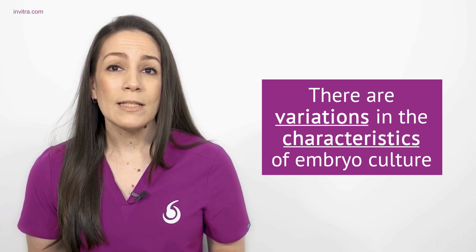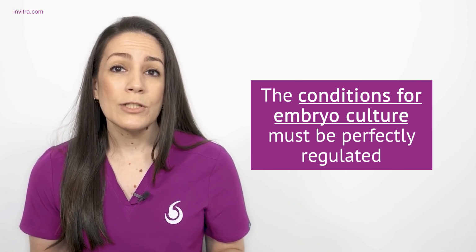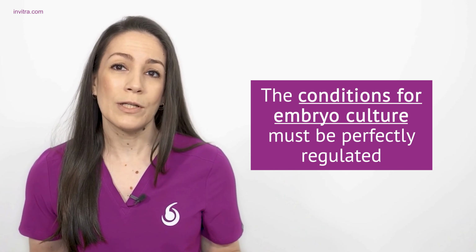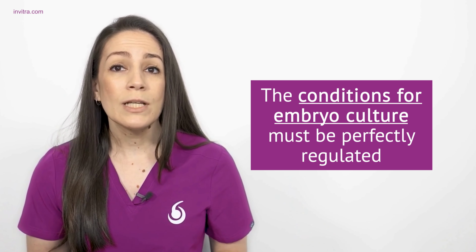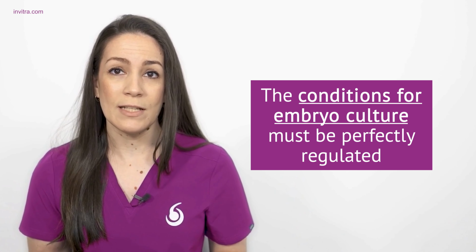There are variations in the characteristics of embryo culture among different clinics and even among patients. However, they always agree that the conditions for embryo culture must be perfectly regulated, as any alteration can affect embryonic development and compromise the chances of success in fertility treatment.